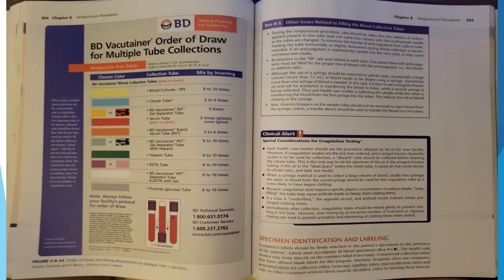However, if coagulation studies are the only test ordered and a winged infusion butterfly system is to be used for collection, a discard tube should be collected before drawing the citrate tube. This is the only way to rid the specimen of the air in the winged infusion tubing. If this air in the dead space enters the citrate tube, it causes an inaccurate blood to citrate ratio and false test results. When a syringe method is used to collect a large volume of blood, usually two syringes are used, so blood from the second syringe should be used for the coagulation tube as it is less likely to have begun clotting.